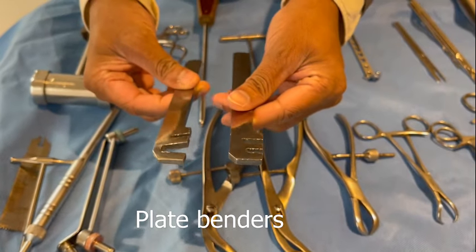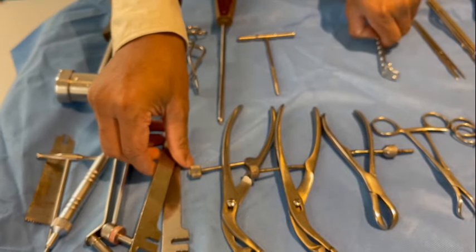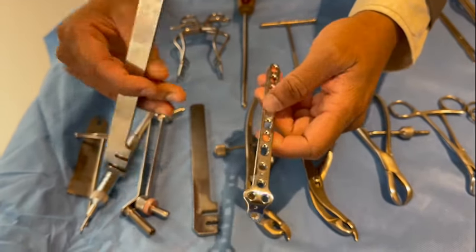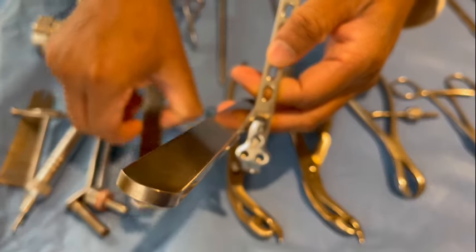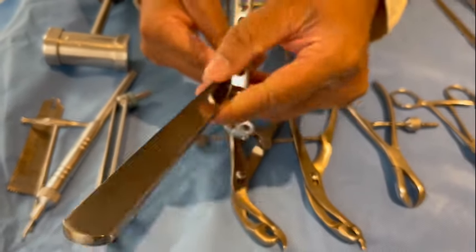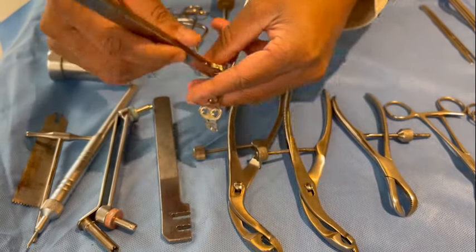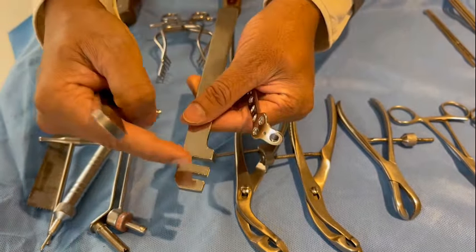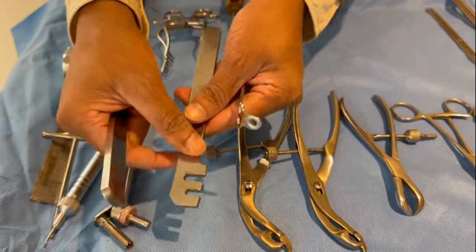This is a plate bender. You use the bender in two different directions in order to bend the plate in either direction. There is a more narrow slot for the 3.5 plates and a broader slot for the 4.5 plates.